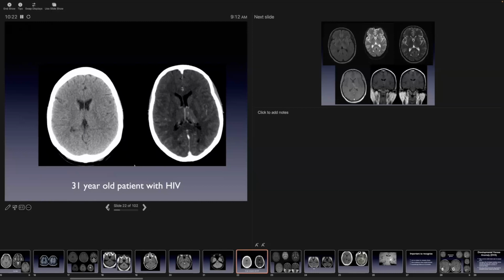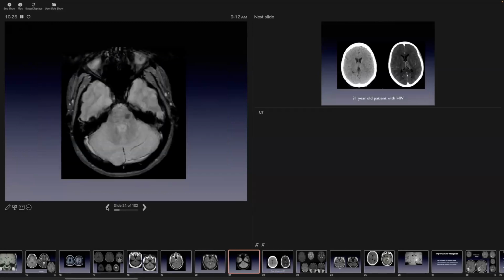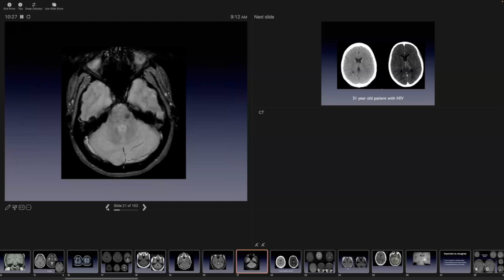What's very common, where sometimes people get carried away, is in patients that have had, say, shallow flip angle gradient echo imaging, and then on follow-up have an SWI scan, or they have a scan at 1.5T, then they have 3T. So the conspicuity of the signal dropout from susceptibility effect, of course, varies with the sensitivity of the pulse sequence and the field strength of the scanner. So I think that accounts for some of the cases where it's done with low field and maybe not with a true SWI scan, you may not see this effect. Okay, thank you.